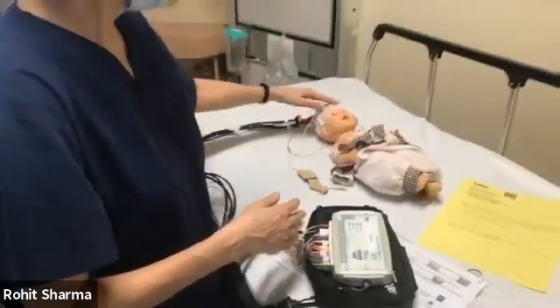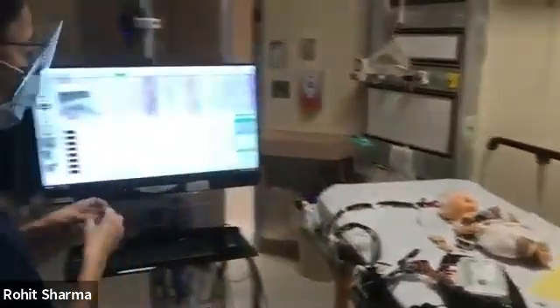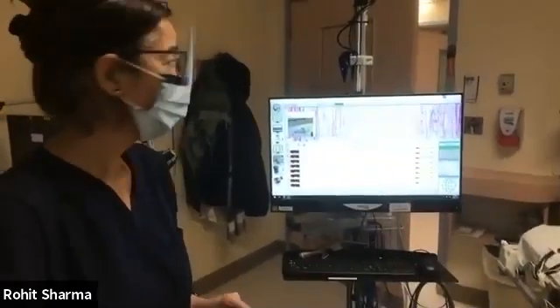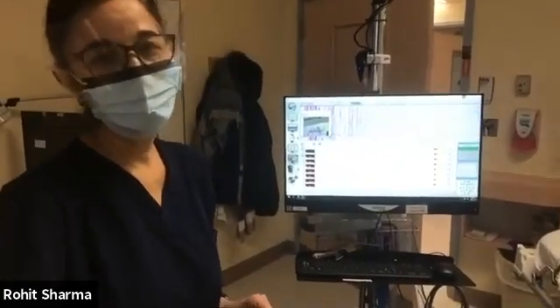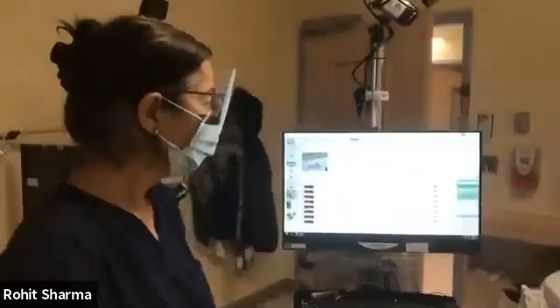The rest are. So basically, when you take the electrodes off the head, just take them all off. You can put them in a bag, or you can wrap the ends up, put them in the back of the machine, and then we'll just come get the machine. Any other questions, guys? I don't think so.